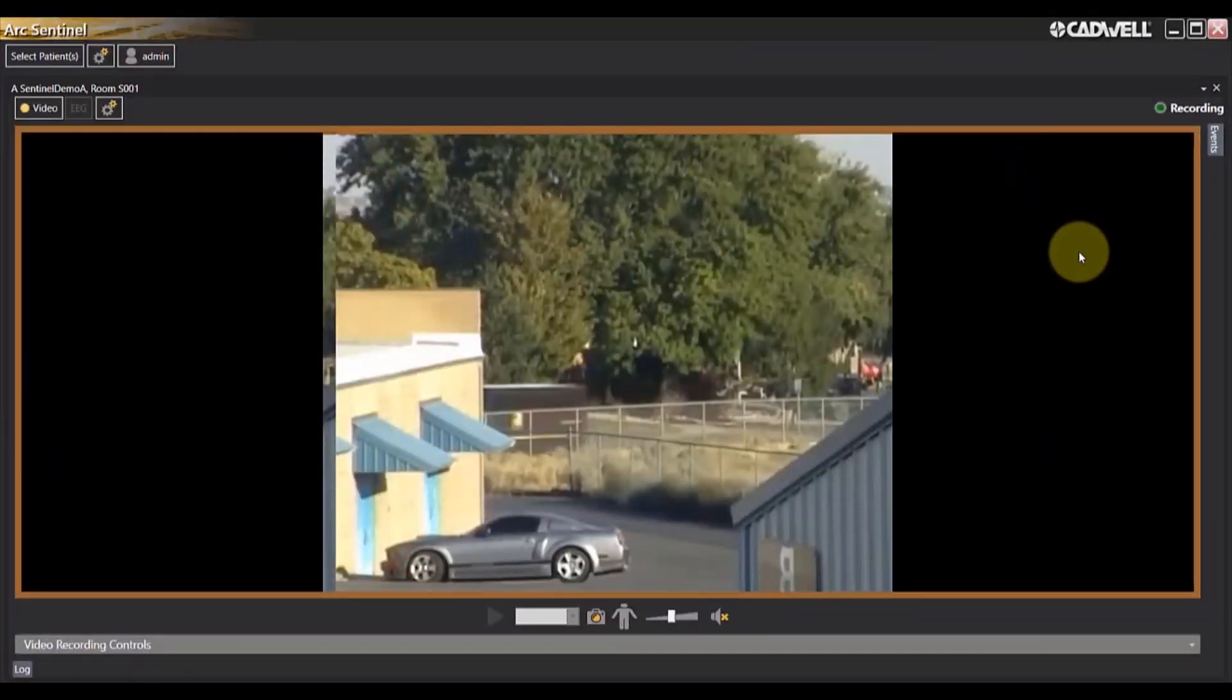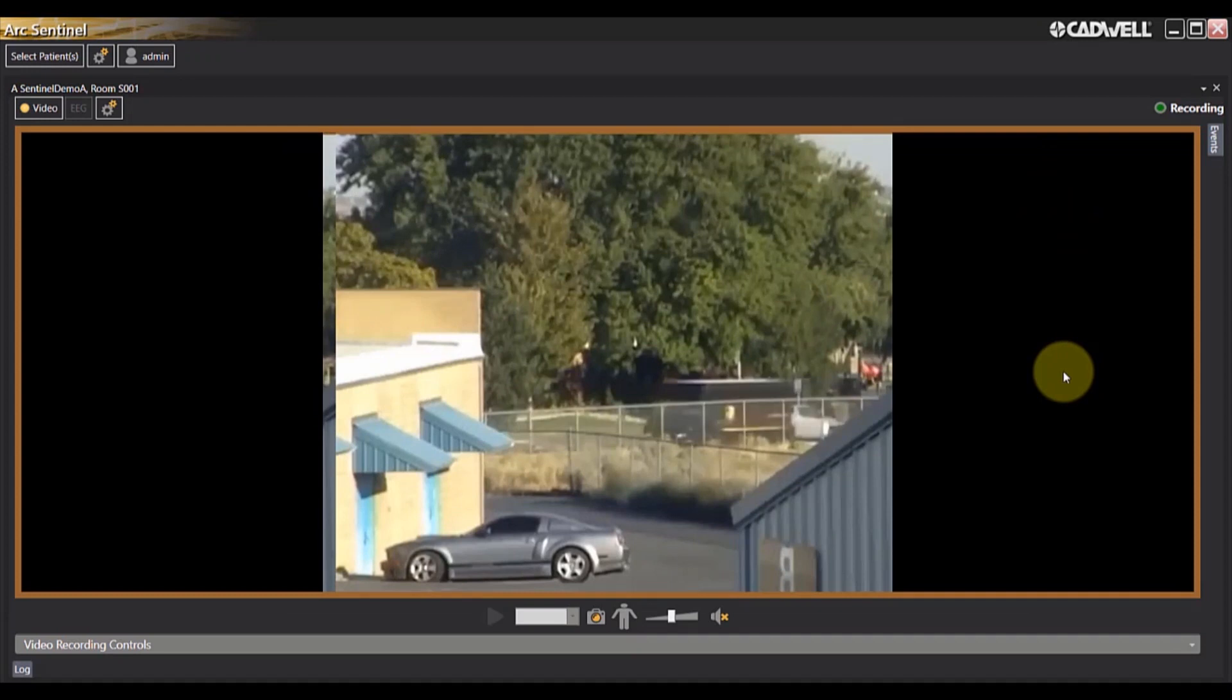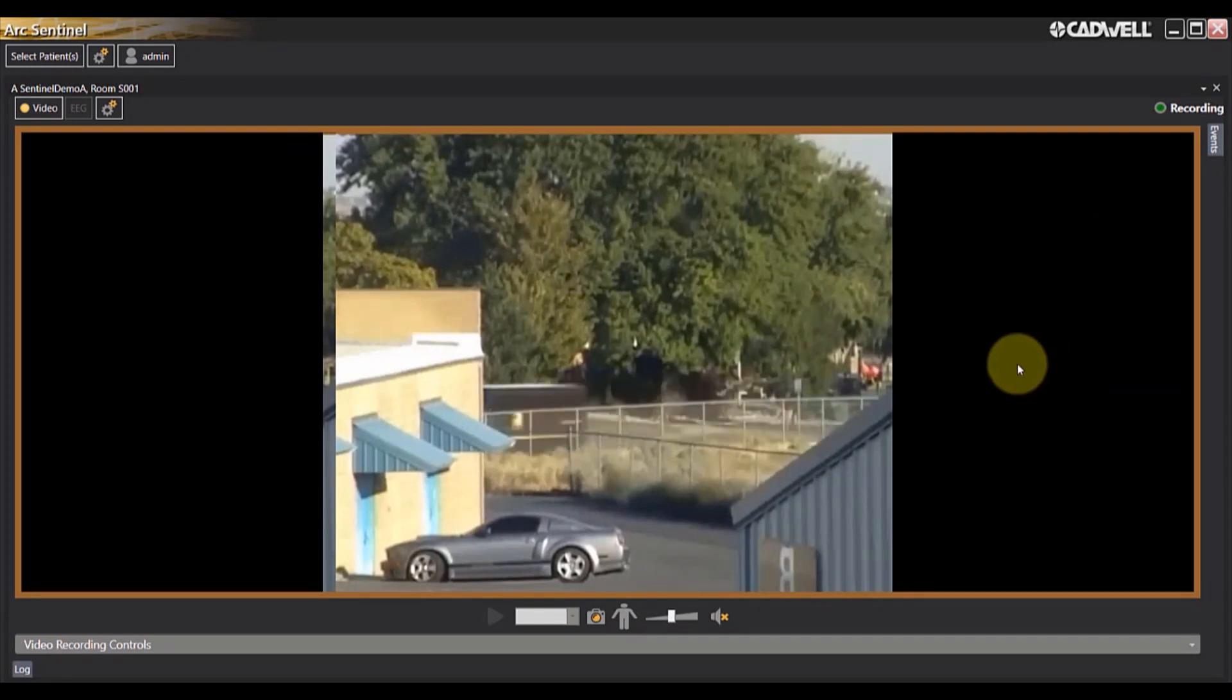Once selected, the video from the patient's room will be displayed on your screen.